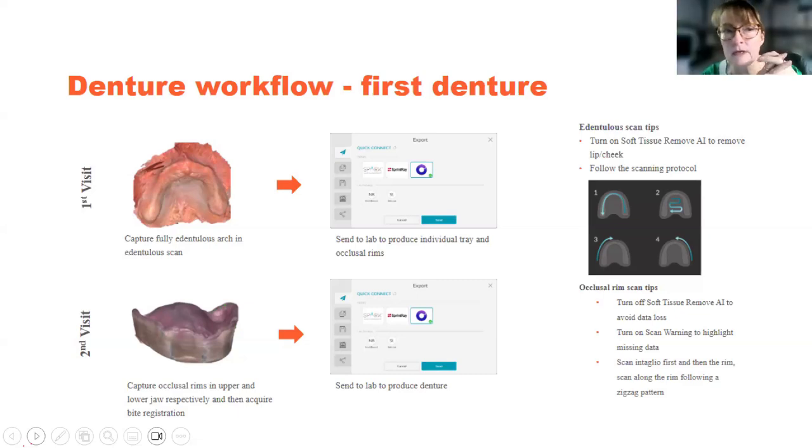So in this particular scenario, the edentulous scan you could think of as an alternate to create a preliminary impression, to create a custom tray or a bite block. My vote would always be for a bite block. And then probably to take a wash impression inside of the bite block and a 360 scan of that, to save you some chair time and an additional 1 to 2 appointments.